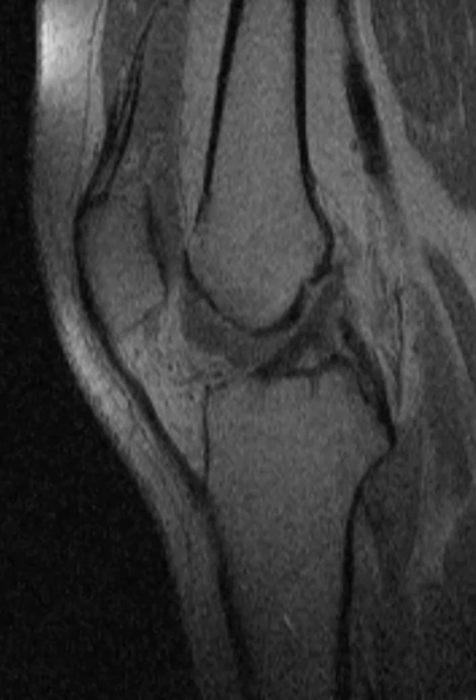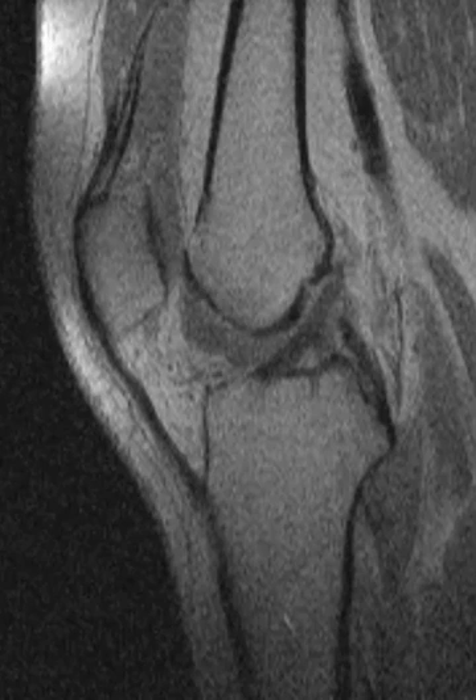Hello, this is Dr. Gay from First Lake MRI. This is a 23-year-old female who was injured on the job, had some knee swelling and pain, and came in for an MRI. We noticed that she had some fluid in the knee joint — the suprapatellar pouch was distended — and also some fluid in the front of the knee.